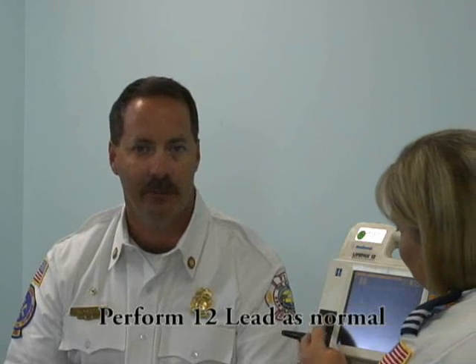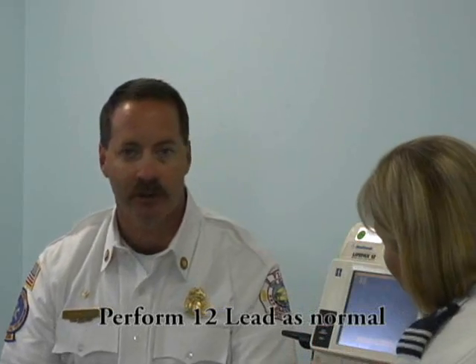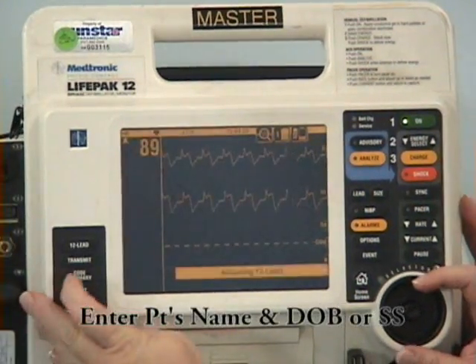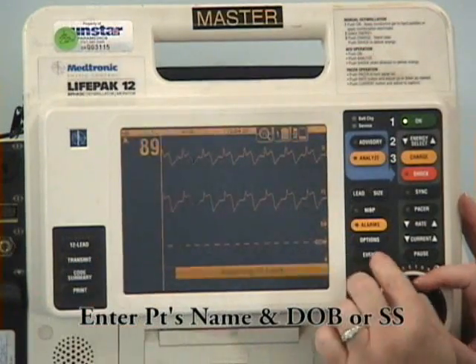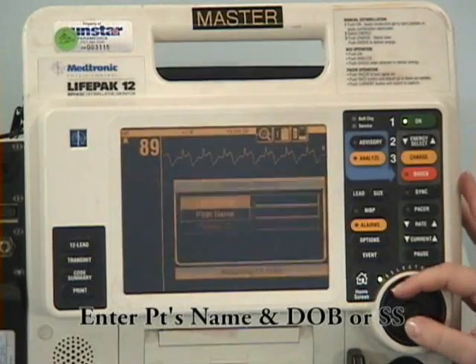Okay, so let's see what that's going to look like on the monitor. Remember, we're going to be multitasking, so while we're setting up our Lifepak 12 to send a 12 lead, we also need to be entering patient information on it. To do that, let's choose Options on the right side of your Lifepak 12. Patient will be highlighted. Push the toggle button to accept patient.